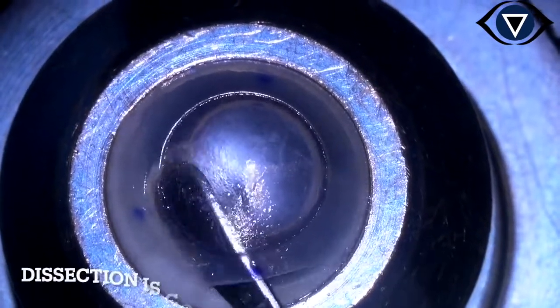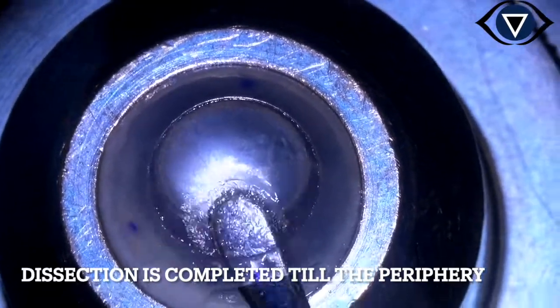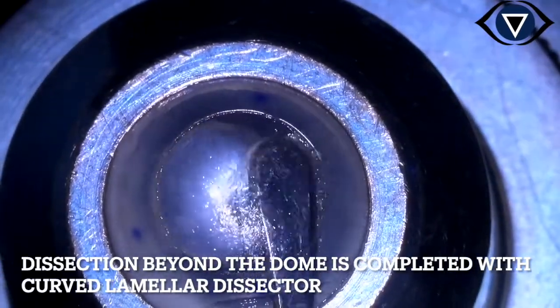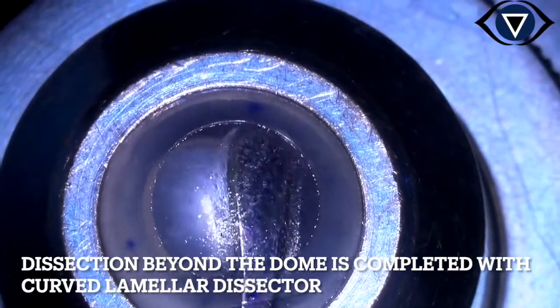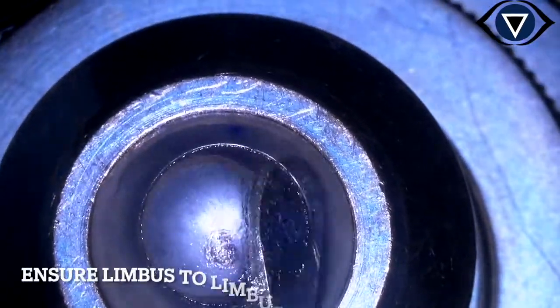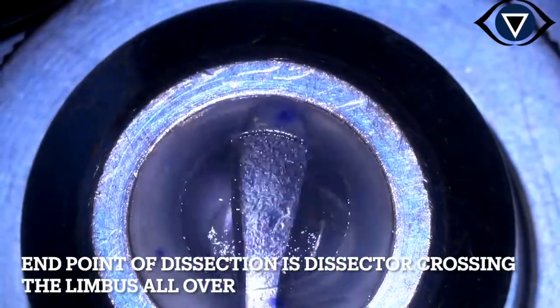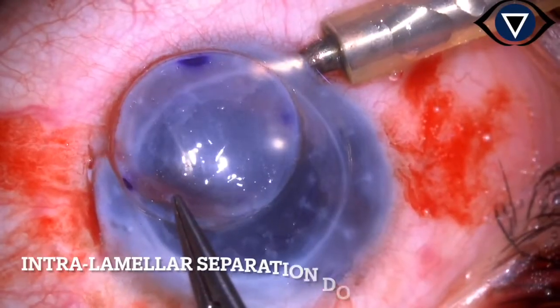In a similar manner, the dissection is completed till the periphery. After the dome of the cornea, the dissection is completed with a curved lamellar dissector. At the end, we have to ensure that limbus to limbus lamellar dissection is complete. The curved dissector is moved in all directions to ensure it crosses the limbus in all directions.